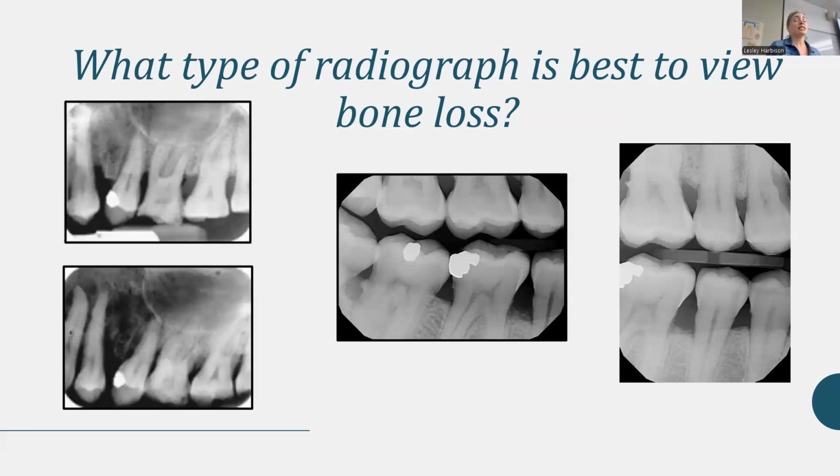You could go all next semester without taking vertical bite wings. But hopefully, once you see a patient and you have to take verticals, all of it will come flooding back. That's my hope. So that's why we've taken more vertical bite wings. But just here is this happened in senior clinic when I was filling in last week. One of the students took this, it wasn't this picture, but it was like this. And this is what the patient needed.